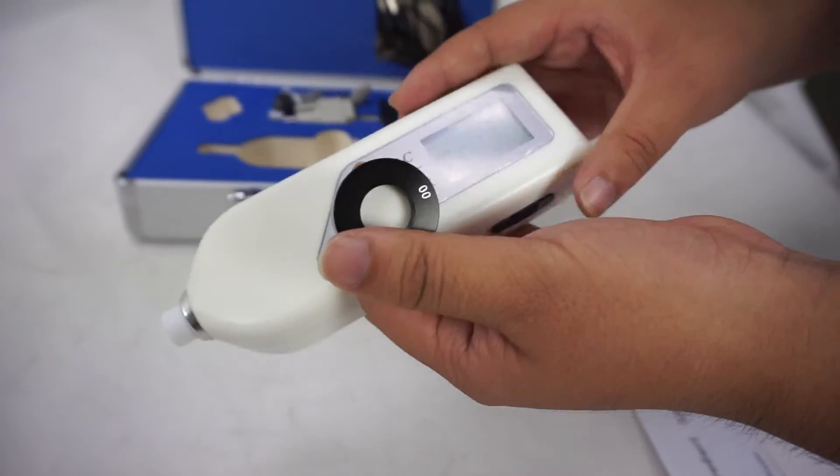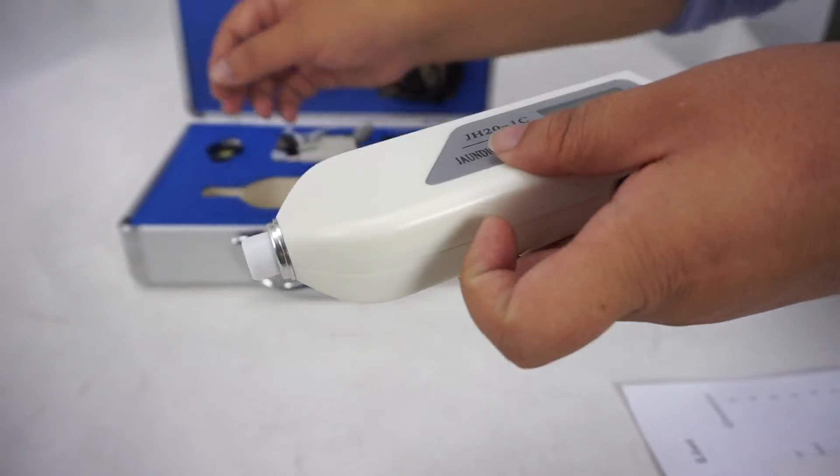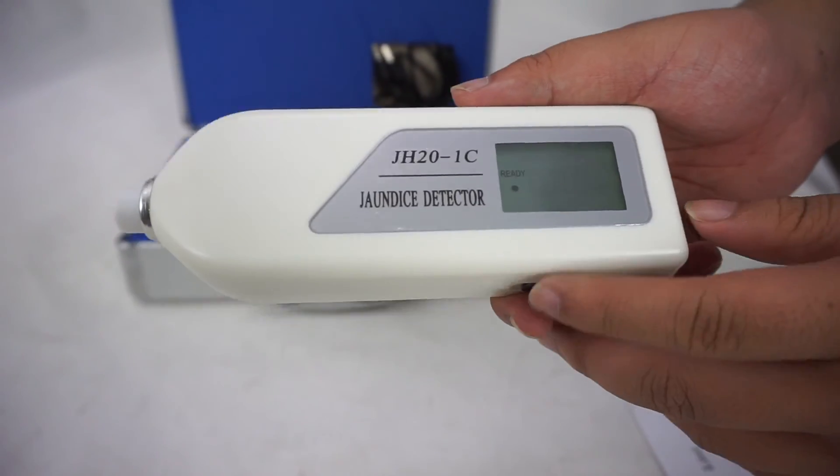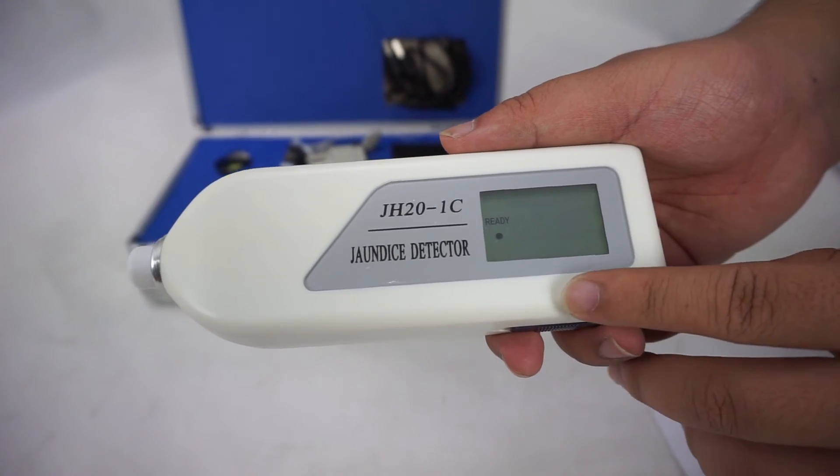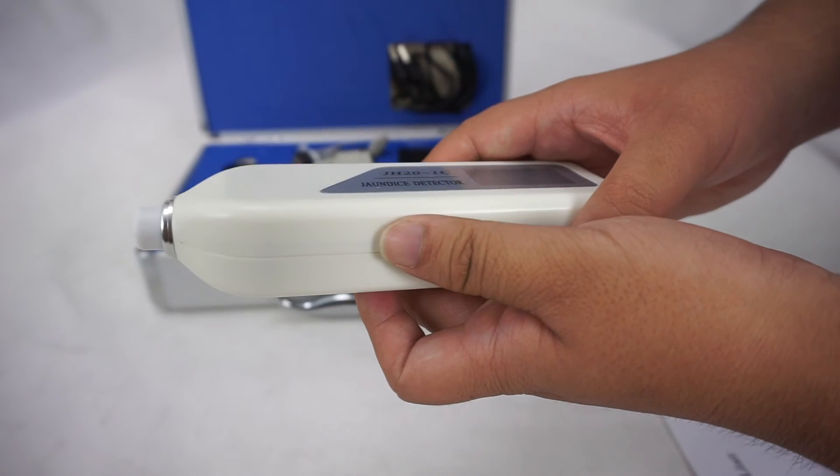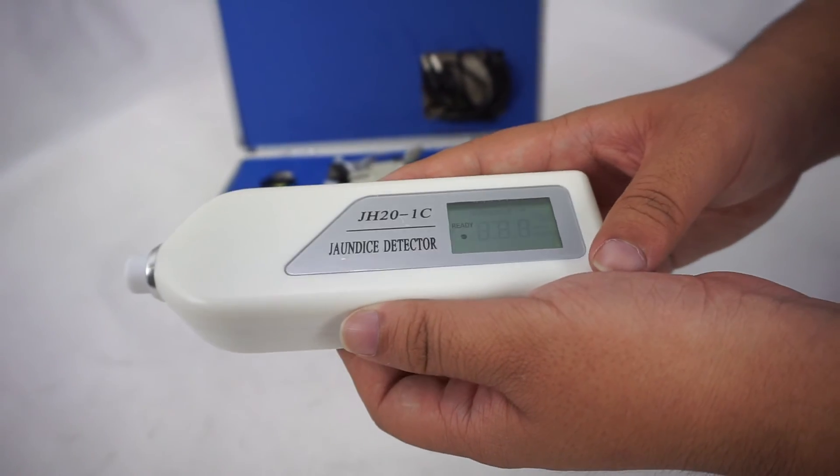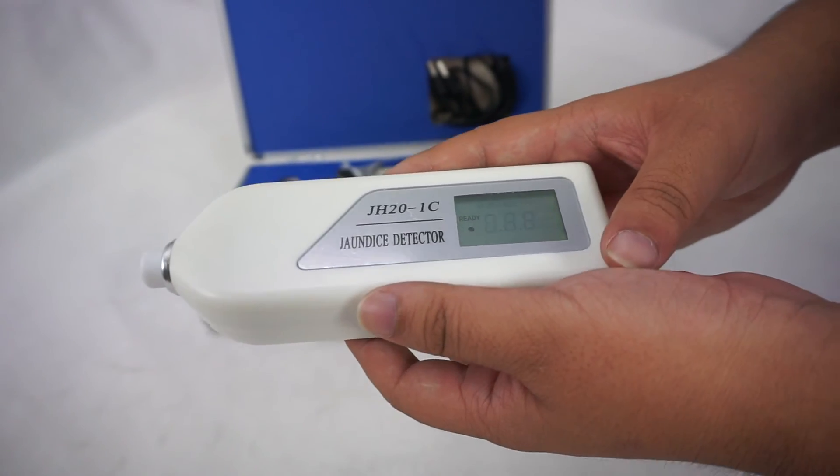See, I will show it again. When checking the machine and we check it is working, then we could use it to detect on the forehead.